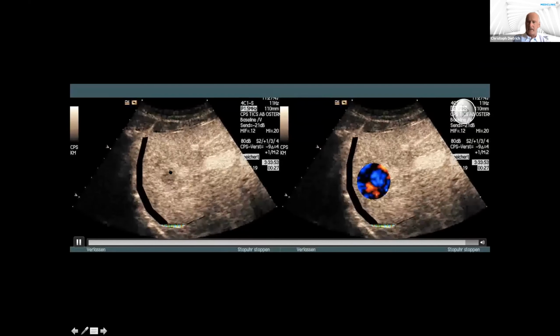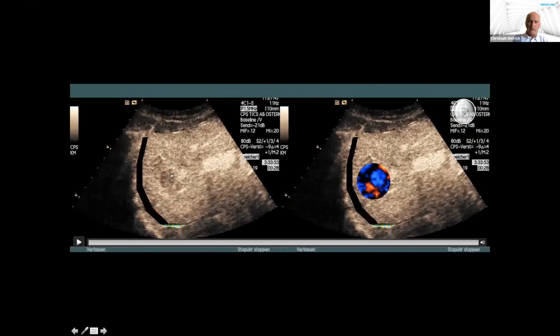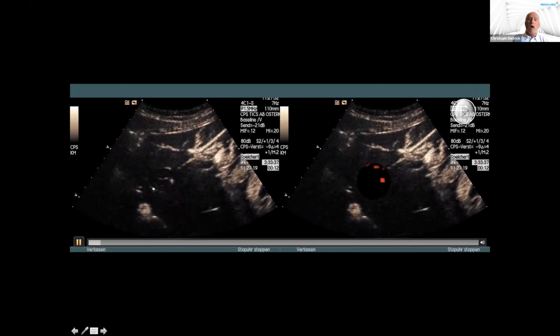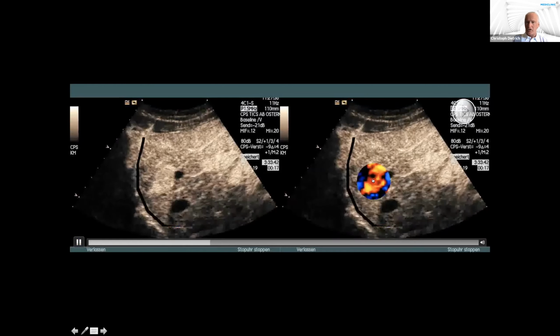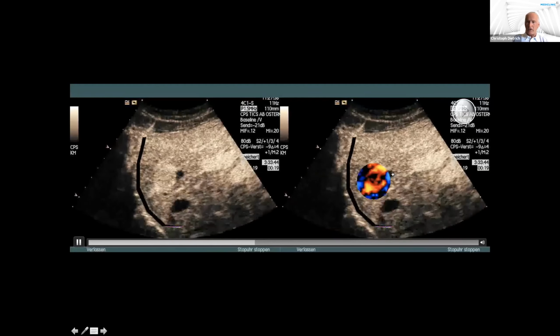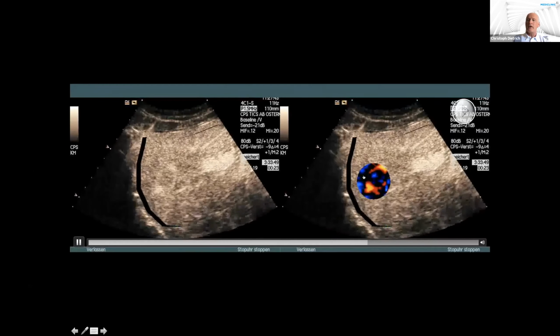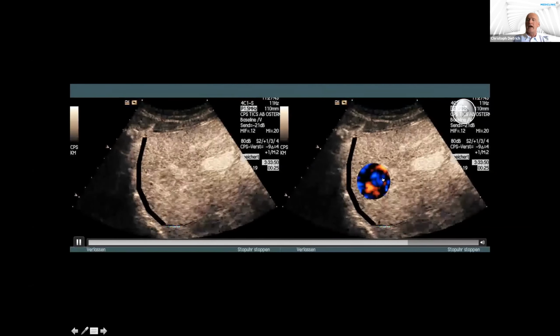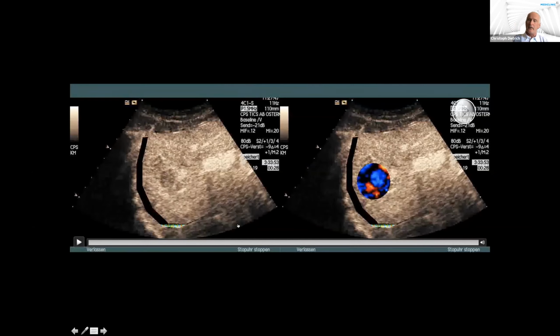Within a few seconds, you will never see that by using computer tomography and magnetic resonance imaging. You can see clearly the moment of hypo-enhancement, wash out. Hyper-enhancing, orange, blue, hypo-enhancing. Portal vein is enhancing right now. The lesion is hypo-enhancing, showing blue color. Dynamic vascular pattern shows clearly the moment of wash out.